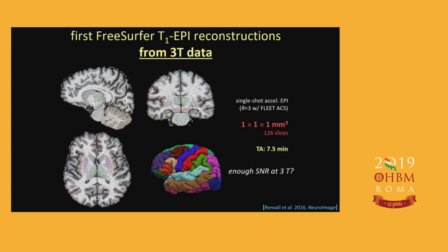This gets around, I think, one of the biggest problems with fMRI analysis, which is to get accurate alignment of the functional data to the anatomical reference. This becomes more and more important as we push to higher resolutions in order to achieve sub-millimeter accuracy. So I think this idea of generating cortical surface reconstructions from anatomical reference data that's exactly distortion matched to the fMRI data is a good strategy.